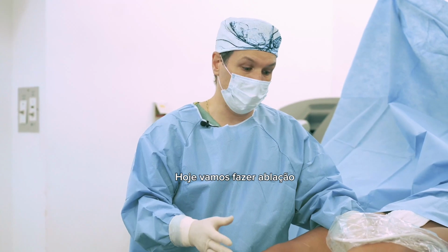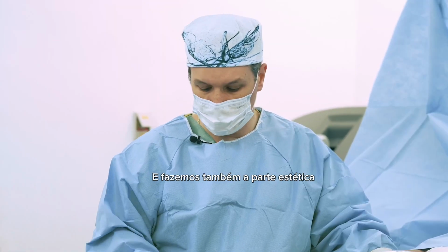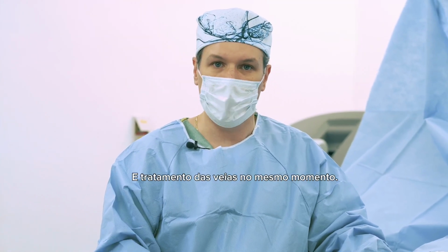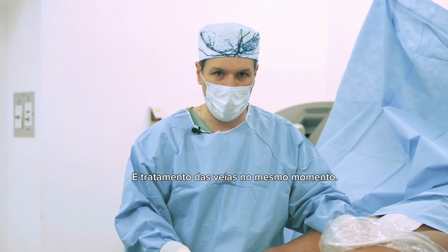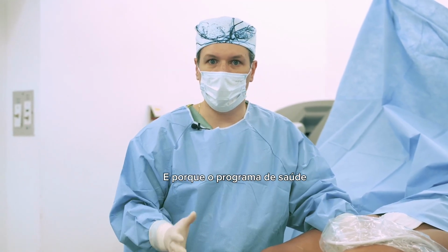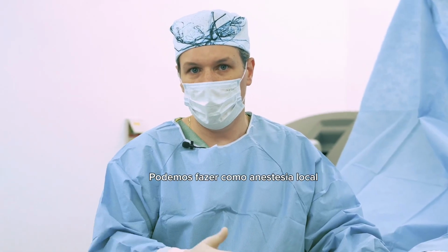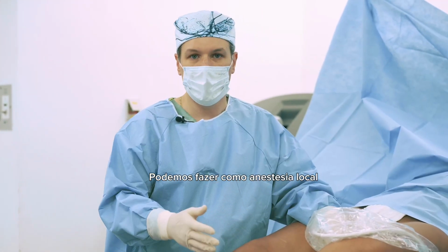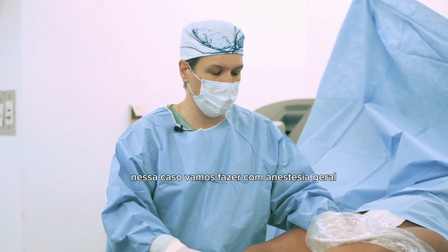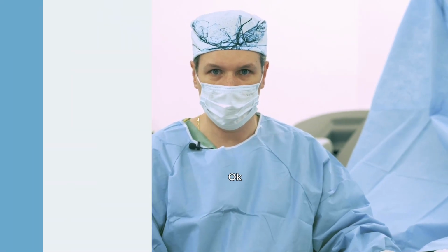So today we're going to do ablation of the left saphenous vein, and we also do the aesthetic applications and treatment of the spider veins at the same time. In Brazil, most women, because of the health care program, sometimes we do it all together, even both saphenous veins. We can do it with rachi anesthesia, but we can also do it with local anesthesia. We're going to do it here with local anesthesia, and the spider veins we do following the surgery, okay?